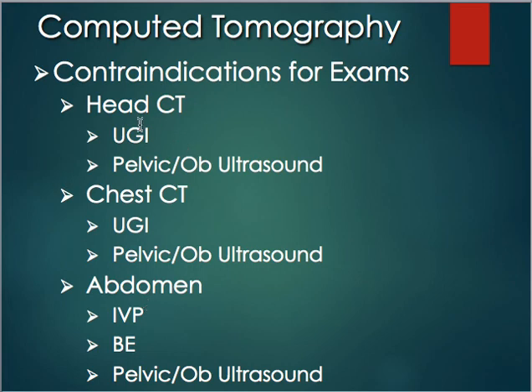Same with an upper GI. You couldn't have the upper GI and then have the head CT because it violated the NPO prep. Chest CT, same thing. Upper GI or pelvic ultrasound, we're violating that NPO prep. So we wouldn't want to have the scan afterwards. Some facilities might forego it, but if the patient has had anything to eat or drink in 3 to 6 hours prior to the injection of contrast, it can cause nausea and vomiting.